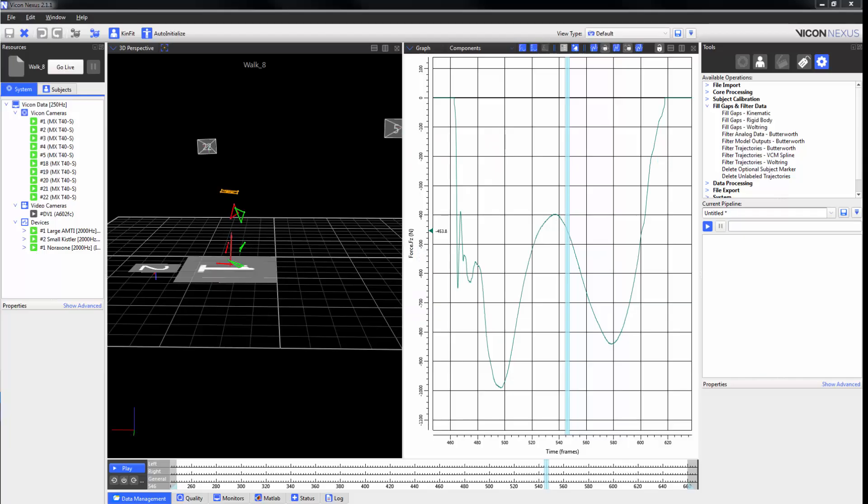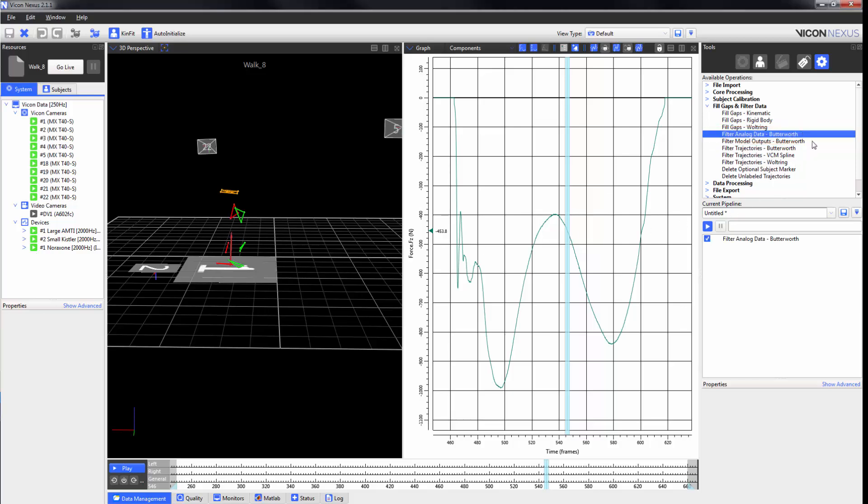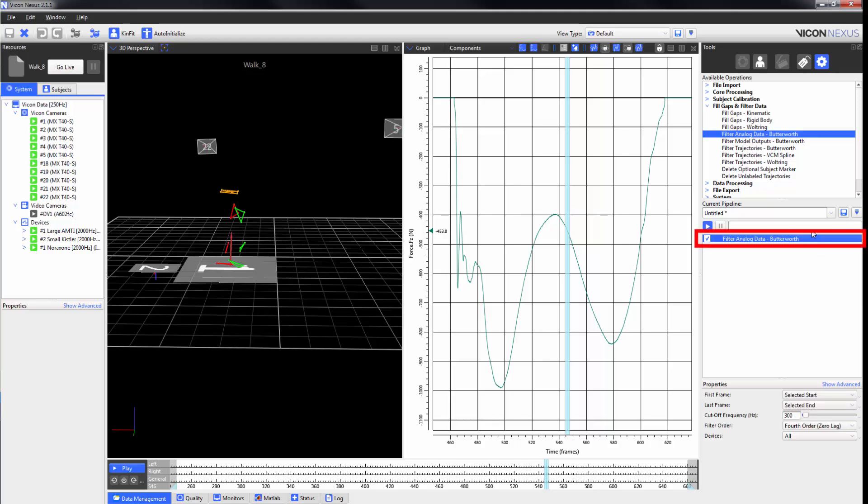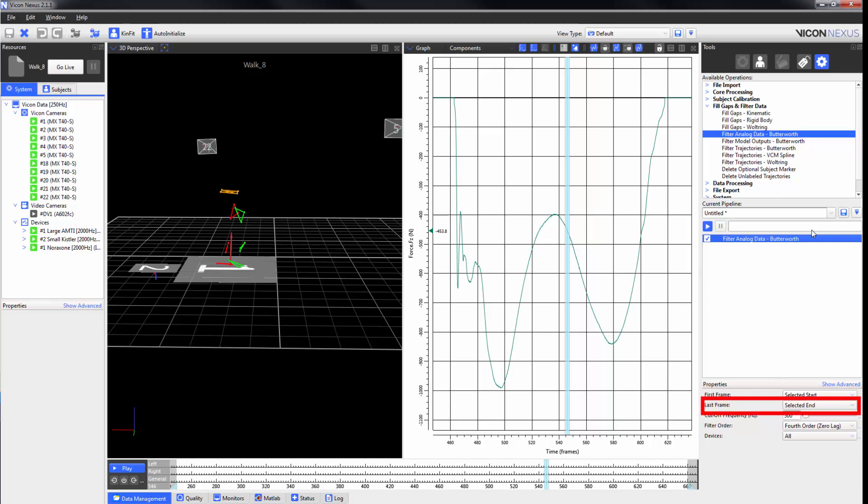We can filter data from analog devices such as force plates by using a low pass Butterworth filter. By selecting the properties, we can adjust the first frame and the last frame. We can also set a cutoff frequency.